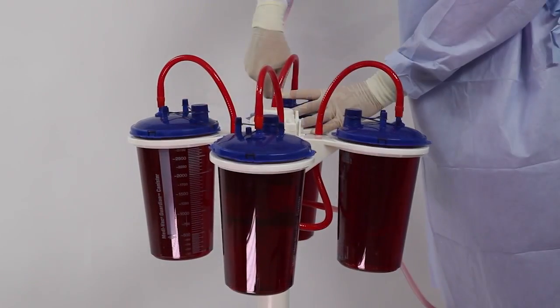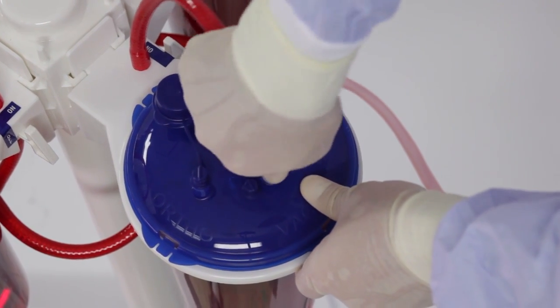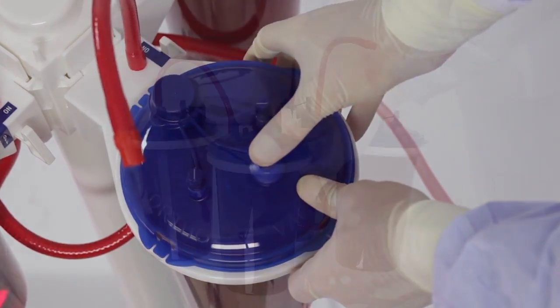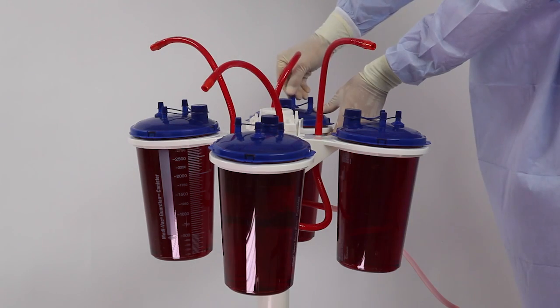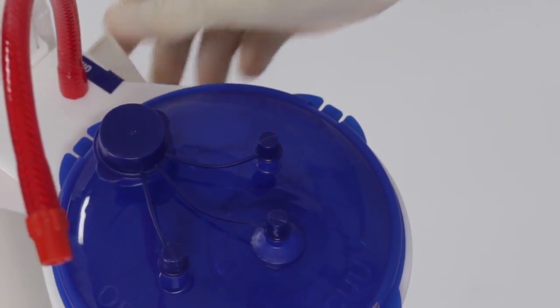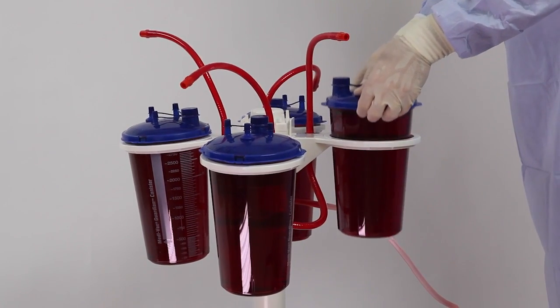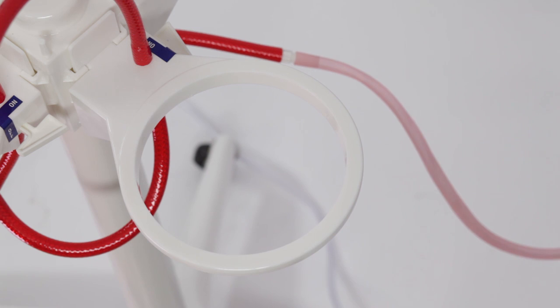With vacuum suction still on, disconnect the red braided tube from the vacuum port on the first canister and securely cap the port. Repeat this process with each canister. Once all ports are capped, turn vacuum suction off using either the vacuum regulator or the on-off valve on each of the ring brackets. Remove canisters by lifting upward on the rim of the lid and dispose of in compliance with your facility's protocol. Do not discard the ring brackets or vacuum tubing.